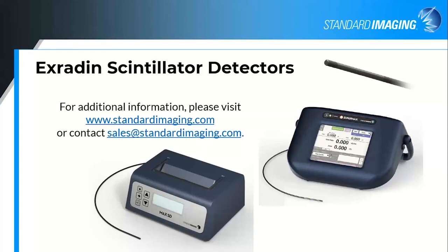Another question is, can we use the detector for Iridium 192 brachytherapy source? There has been a little bit of investigation into some HDR measurements, but again, the Cherenkov is a little bit trickier. There's a threshold above which Cherenkov is produced. And so I think there's another fluorescence dependency potentially with the HDR sources. So I know there are places that are investigating that, but that may not be the best use of our or the easiest scintillator to use for that particular application. We'd love to work with you on some research, though. If you want to contact me offline, we can certainly talk about that.